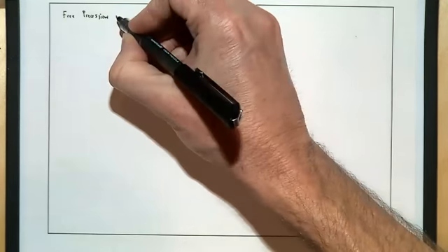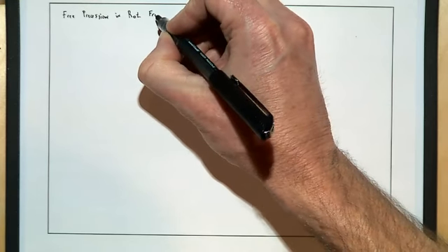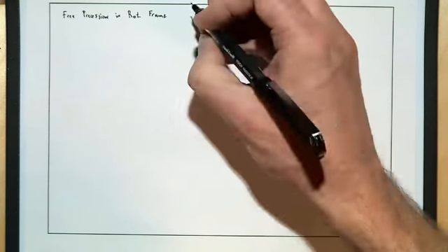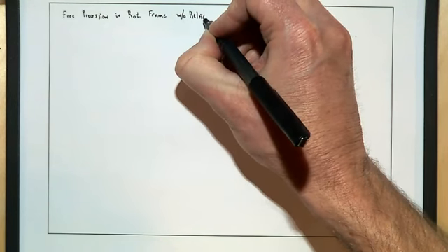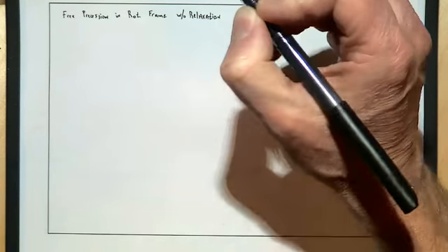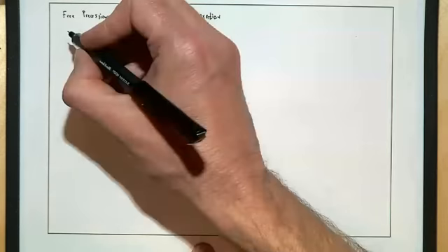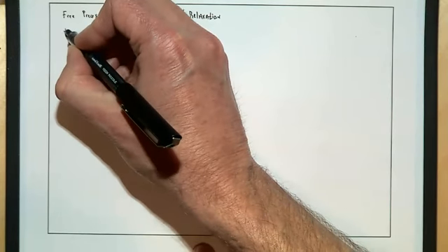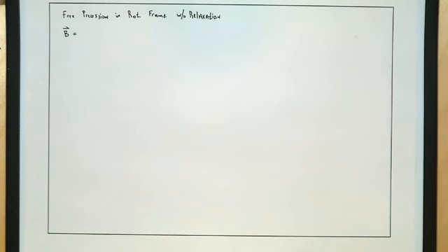This is going to be in the rotating frame. And of course, we're not really worried about relaxation yet. We'll bring that in on, I think it's Monday. Okay, so what's the B0 field if we're just talking about free precession? We have our B vector field. We have to describe it so we can put it into our new rotating frame expression.